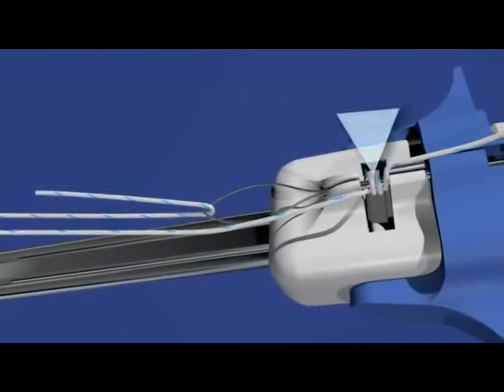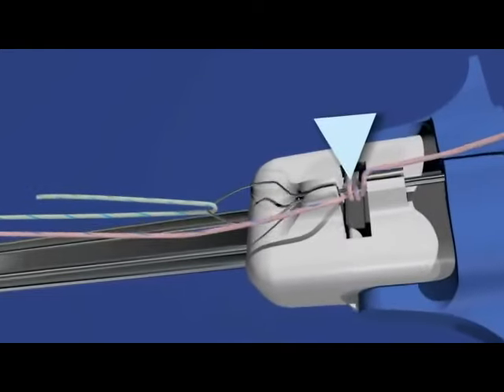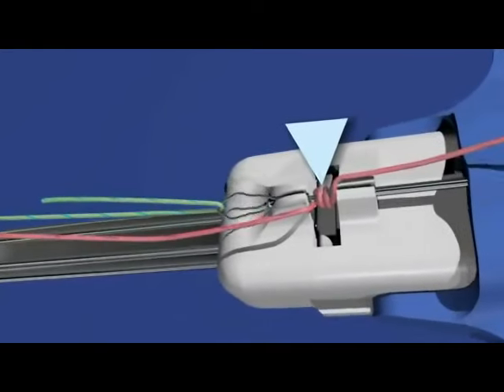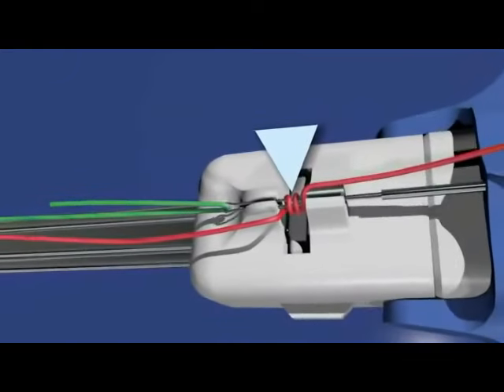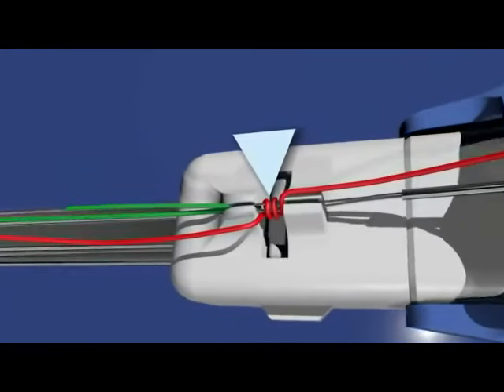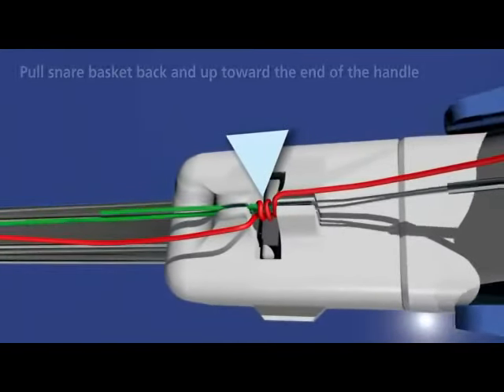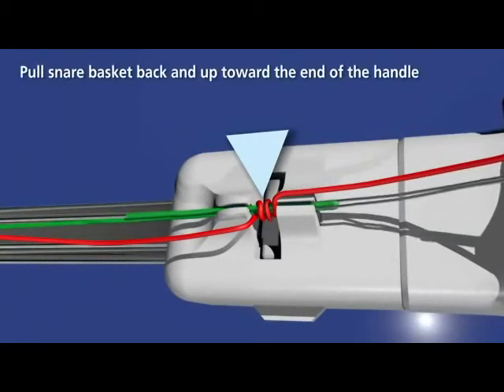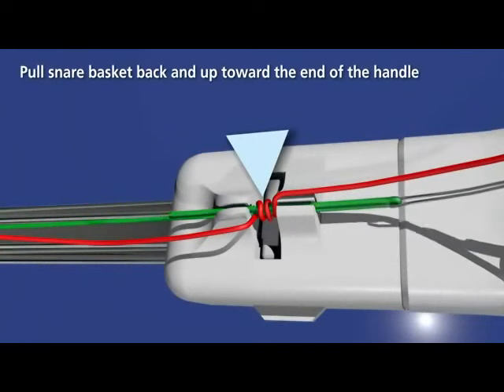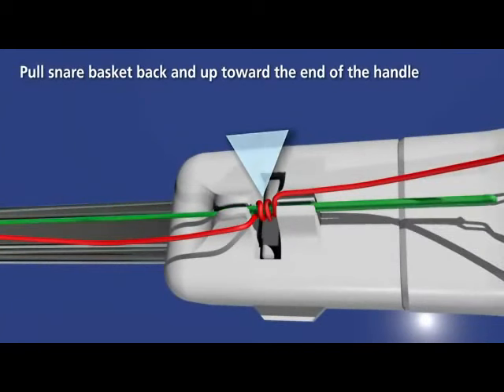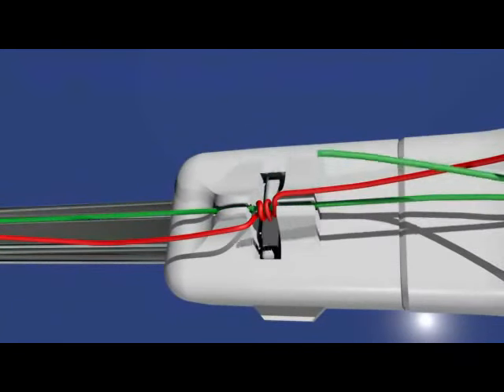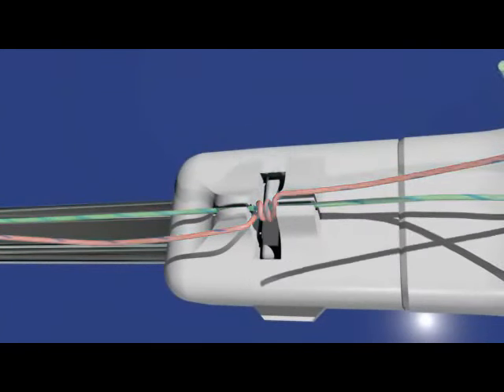Place your free hand thumb over the top of the pre-tied knot, holding it in place. Pull the snare basket back and up towards the end of the handle to thread the suture through the pre-tied knot.